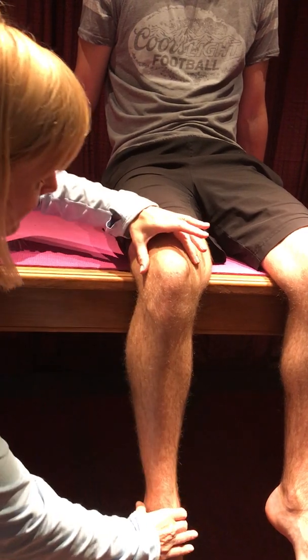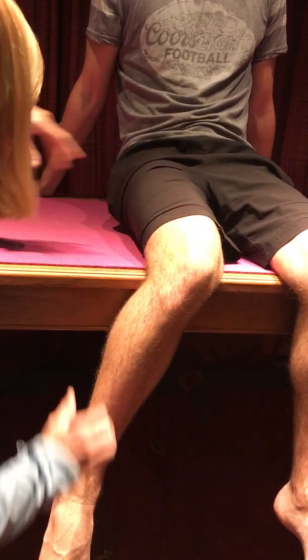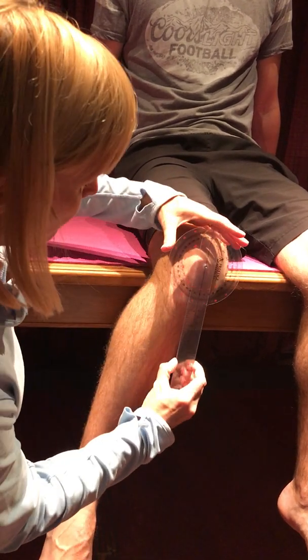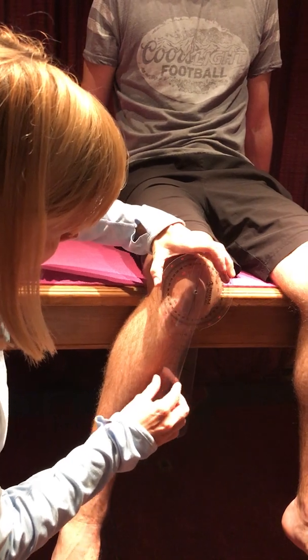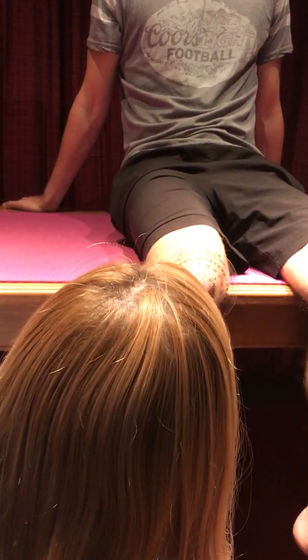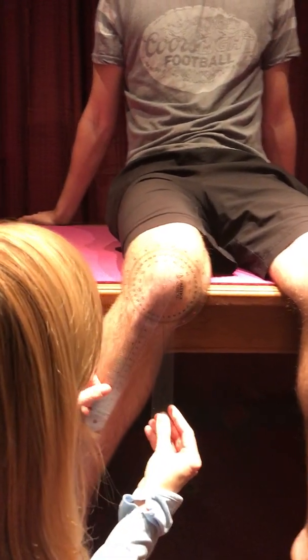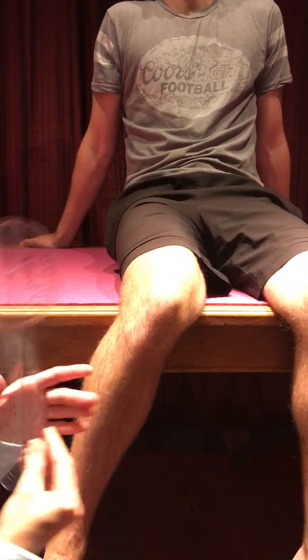We have the person move into internal rotation. Hold that there. It's better if you have a goniometer with a plumb line so you can make sure you're hanging down straight. Assuming that's fairly straight down, we have 25 degrees of internal rotation.